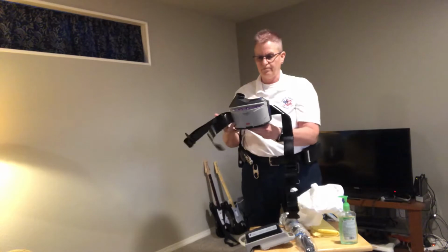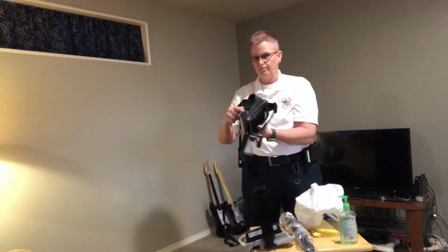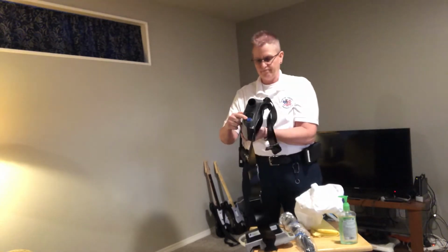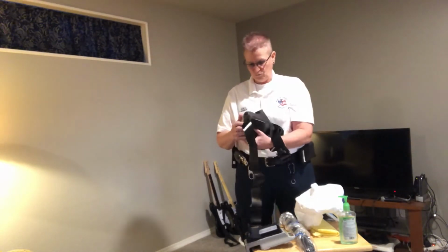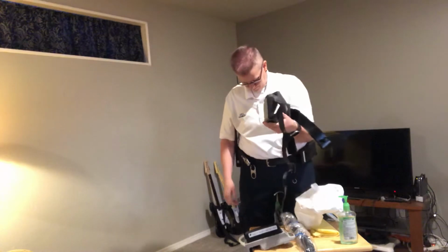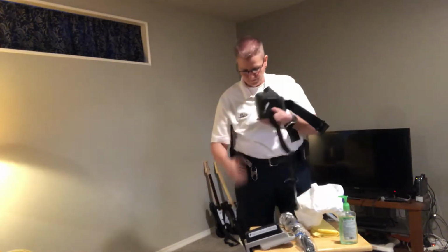The power button is up top in the blue. The strap is adjustable to most anything. I've seen some ginormous human beings in these, and I've seen some itty bitty ones. And then in front of Jody is the battery.